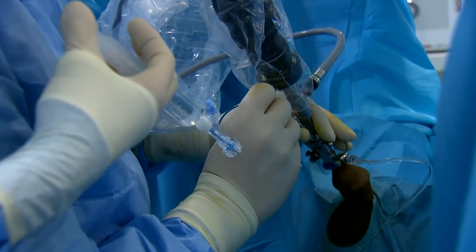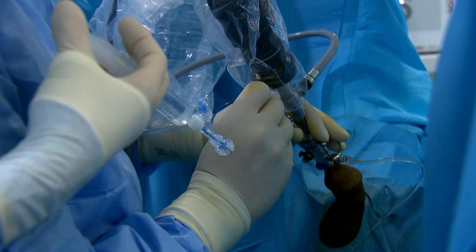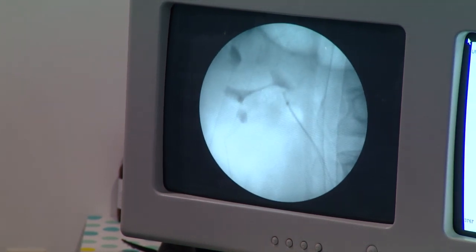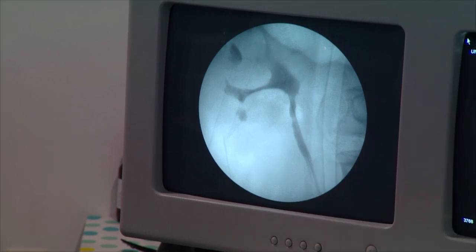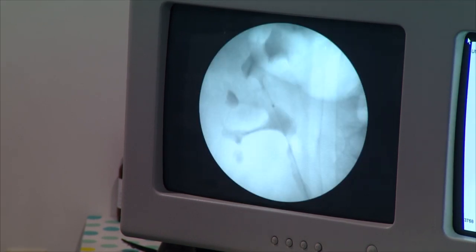Once, a little more contrast. More X-ray. Yeah, just a moment, please. More contrast. X-ray, please. Now we are inside. No, it's okay. Just 1 or 2 centimeters to the head. X-ray, 1 or 2 centimeters like this. A little, only a little. That's all. Once more. Stop. Now we are removing.